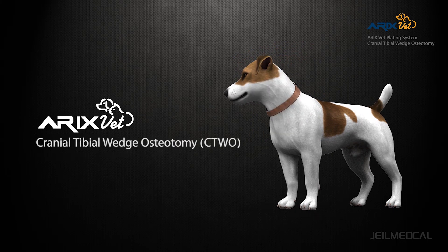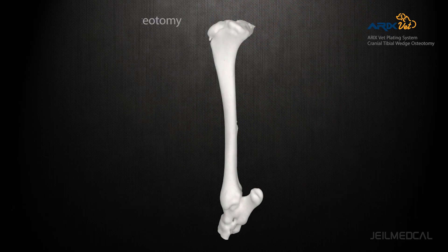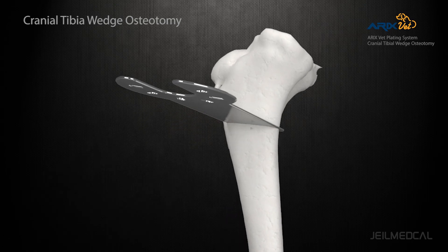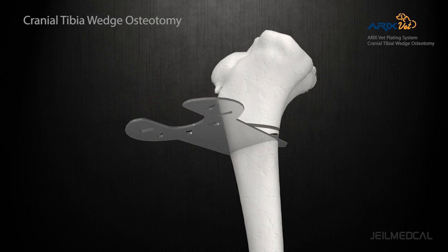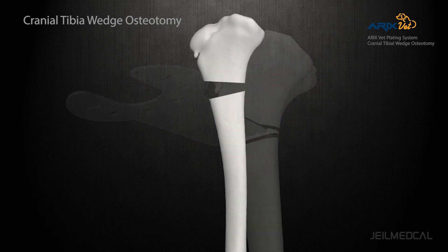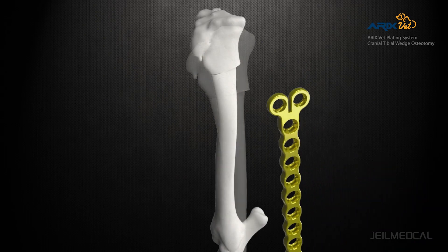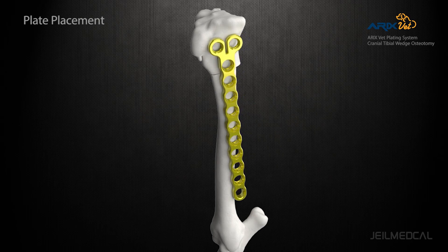Cranial tibial wedge osteotomy technique is for cranial cruciate ligament rupture. The procedure levels the tibial plateau, eliminating cranial tibial thrust. The CTWO technique is based on removing a wedge-shaped fragment of bone from the proximal tibia to reduce the tibial plateau angle.